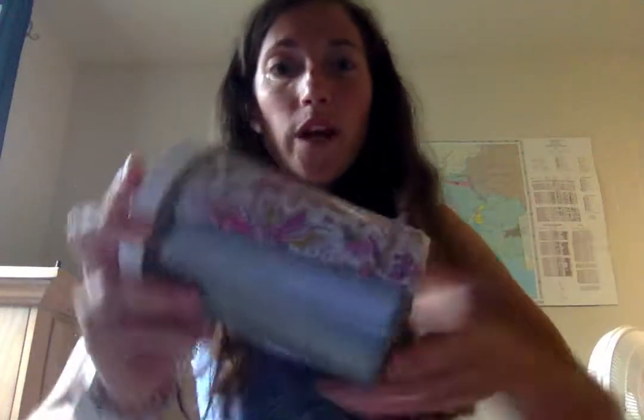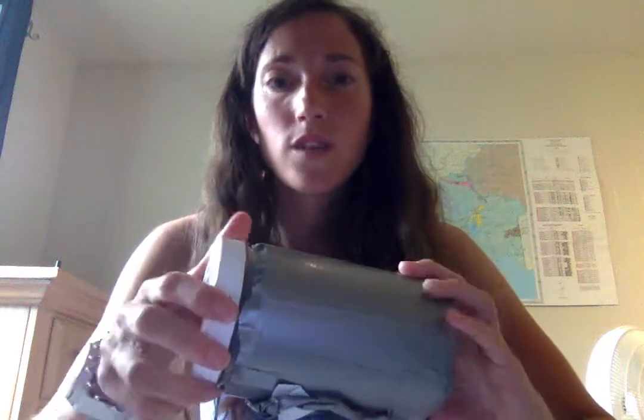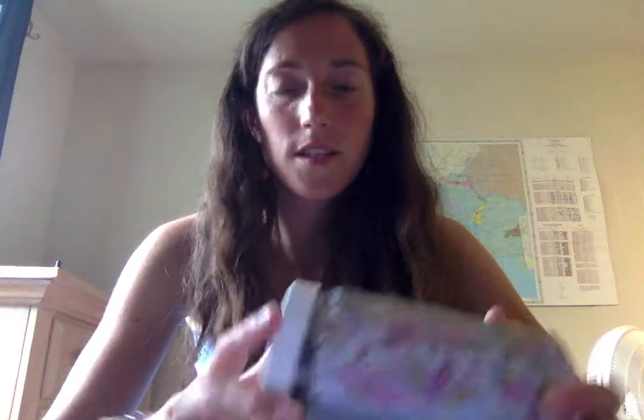And then for skiing or activities where you don't want to end up squishing your bag or worrying as much about odor, using more of a container like this that's kind of its own enclosed system could be pretty handy. I would love to find one of these that doesn't smell as much, so I don't have to add the bag as well, because I'm always trying to find lighter weight, simpler systems.